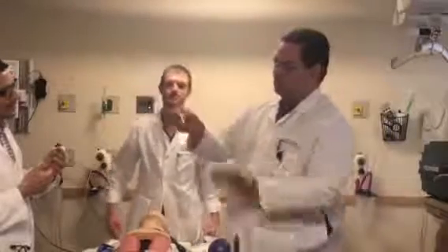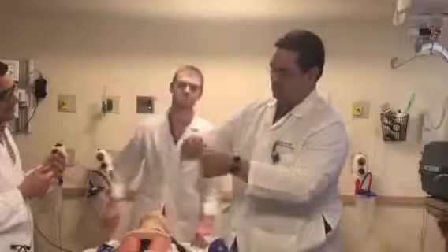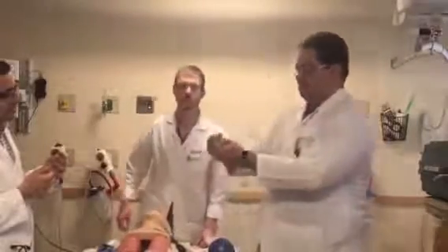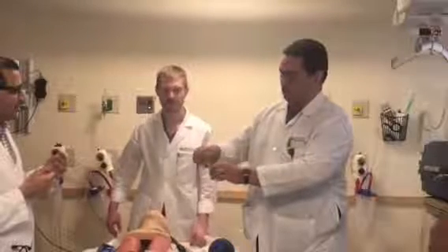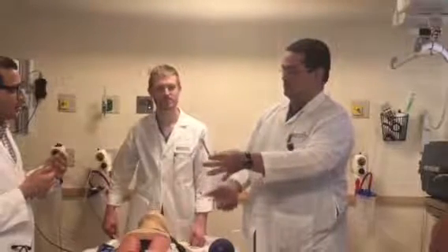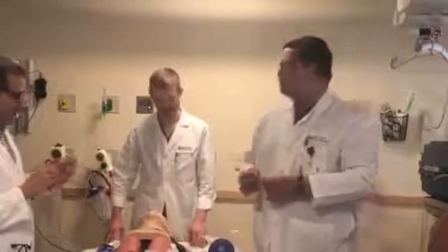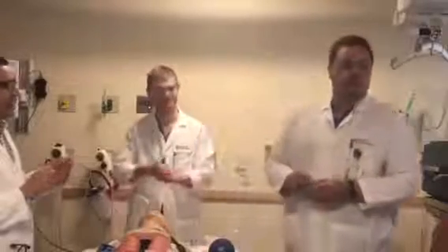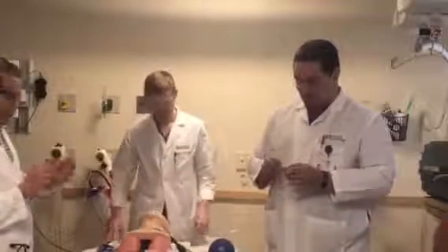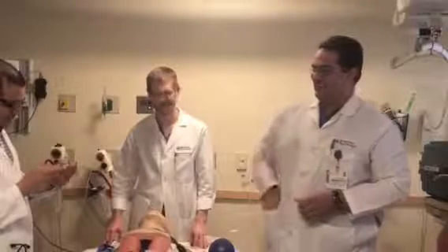You remove this, you puncture, and put it like this. Wow. Done. What's it called? I have no idea. It's from New Orleans, by the way. Have you ever used it? No, I just have it with me. I'm sure somebody's going to find it and throw it in the garbage when I pass through the airport. Yeah, definitely. All right, that's it.